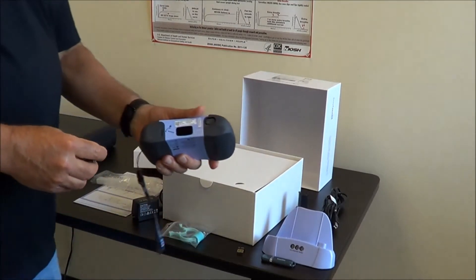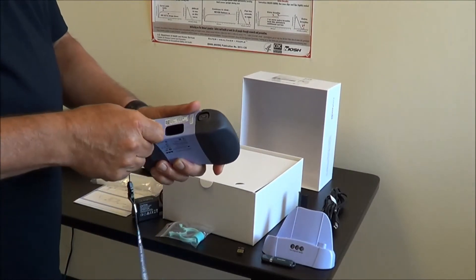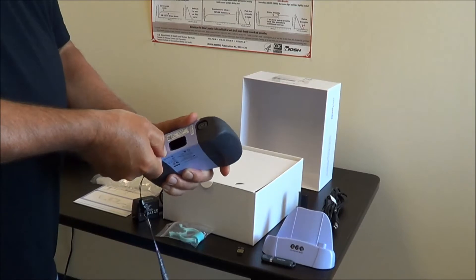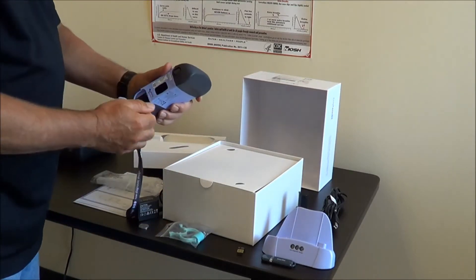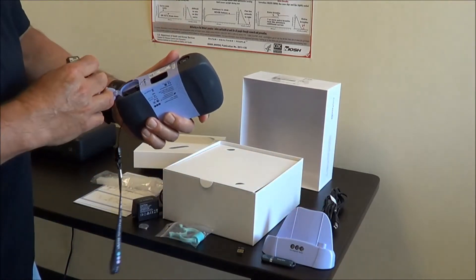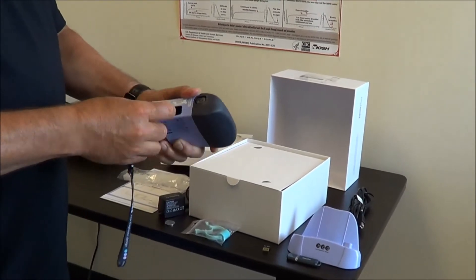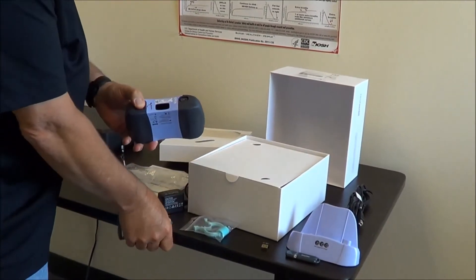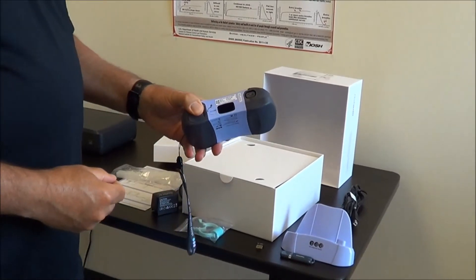Now we're going to install the battery. I recommend using a coin — a nickel works well. Use the coin to open the battery door. Take the battery, find the contacts, slide the battery in, close the door, and use your coin to lock the battery door.